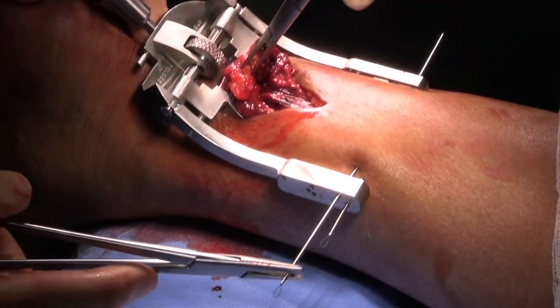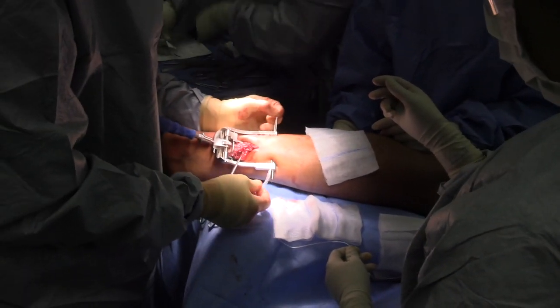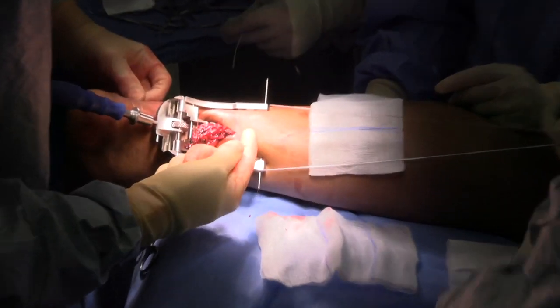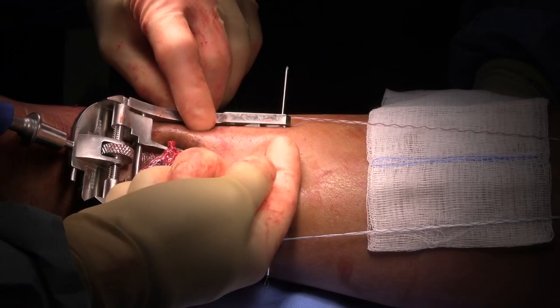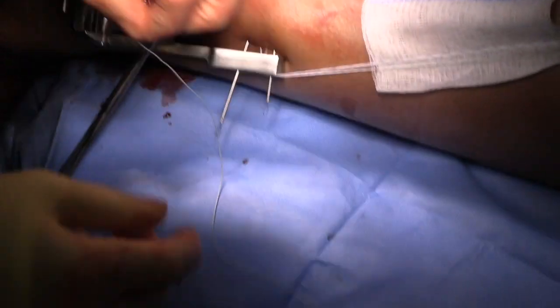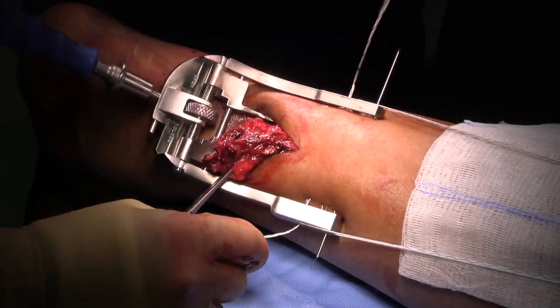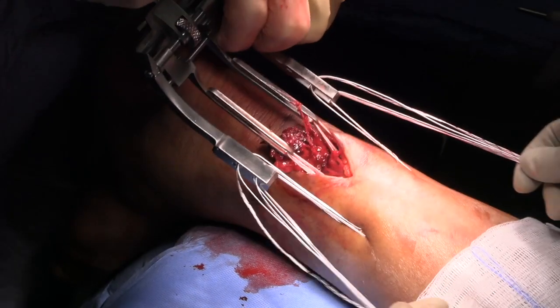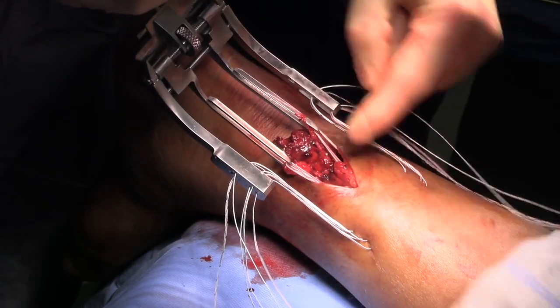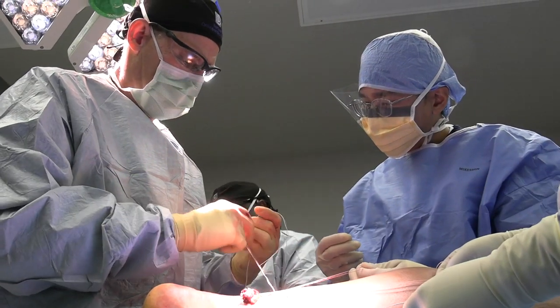We're going to pass these others into suture — number two. Now we've got the suture that goes through the inner part of this, through the tendon, through the middle part of that metal right here, through the skin — so we're passing a suture through. When we pull it out, these little metal things are going to pull the sutures on the inside through the tendon. See how these little metal things are pulling the suture on the inside of the tendon sheath? We have completely grasped the tendon.